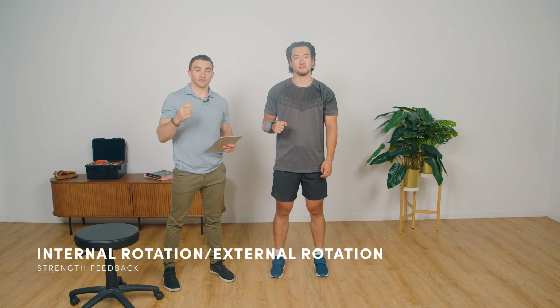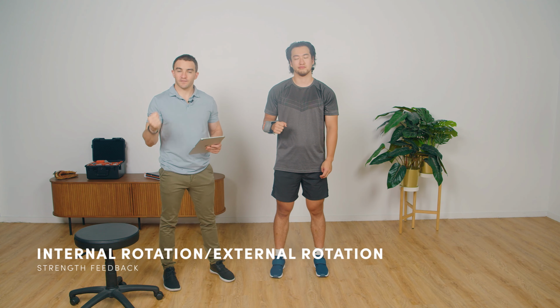However, it's often difficult for a patient to actually know what it feels like to apply 5 kilos or 10 kilos worth of force after they've had surgery. So rather than them picking up a weight, especially in something like external rotation, what we can do is use the dynamometer to give them an idea of how much force they're applying.